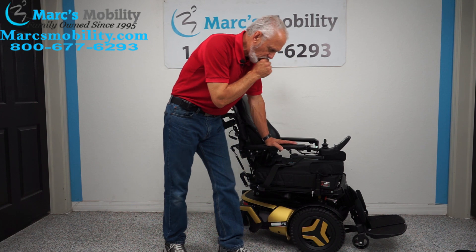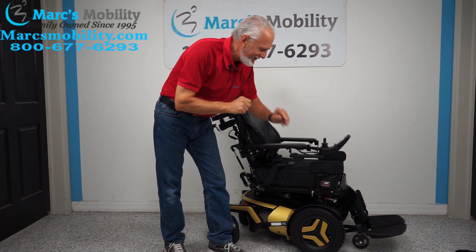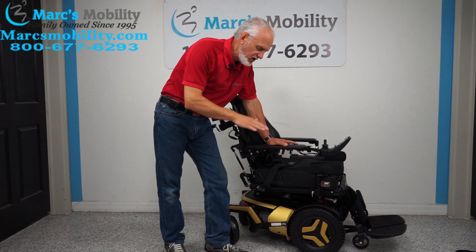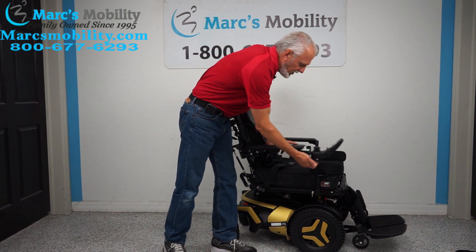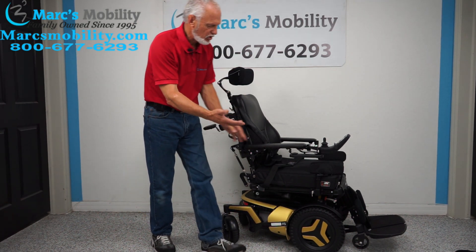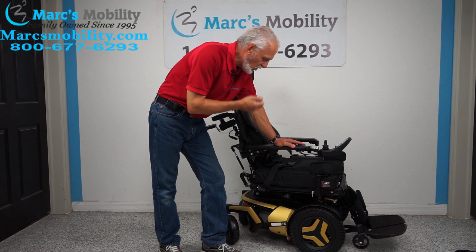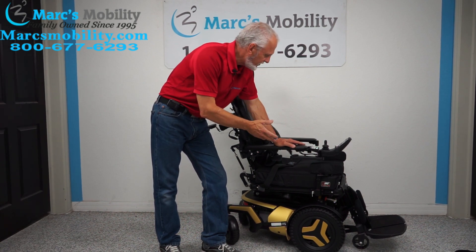To recap: this is the Permobil F5 VS for vertical standing, with seven electrical functions and two miles on it. It has the 14-inch seat lift, electric tilt, electric recline, electric legs, standing position, interior tilt, and legs that go up and down. It also has elbow pads, swing-away joystick, lateral knee pads, custom headrest, push bars, attendant control, charger, and aggressive upgraded tires. This is a one-of-a-kind power chair — the only one I know that has all these features combined with the standing position. If you're looking for the top of the line in power chairs, this is the one to look at.